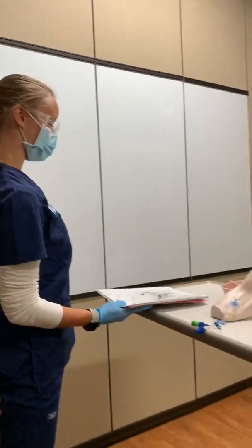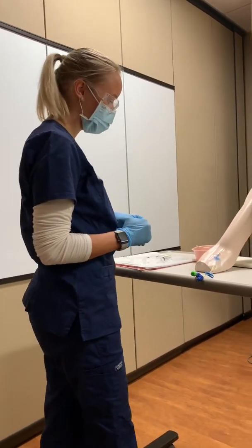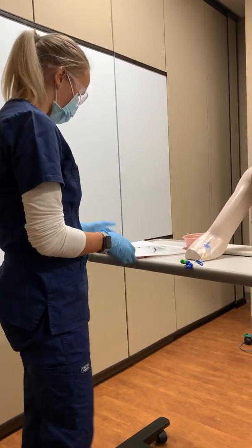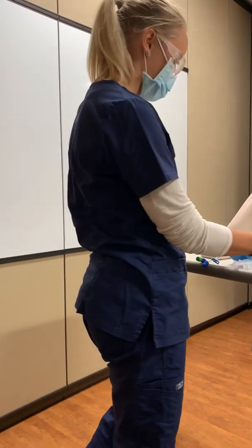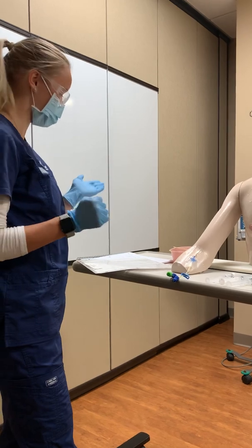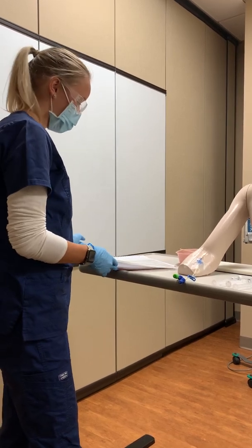Knock, knock, knock. Provide privacy. Wash my hands. Hello, my name is Anna, and I'm going to be the student nurse today. Can you please tell me your full name and date of birth? And everything matches. According to your chart, you requested something for the nausea. The doctor ordered Zofran, and you can get that every 4 hours. Does that sound correct? She said yes. Do you have any allergies at all besides the morphine that you listed?